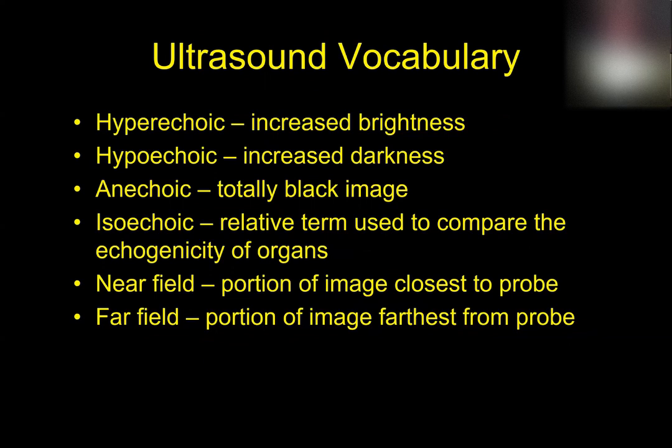So, and then he covered these terms, basic terms, just to make sure everybody knows. Hyperechoic is stuff on ultrasound that appears more white, more bright. Hypoechoic is the opposite. So hypoechoic literally means too few echoes. So that would be something that's a little darker on ultrasound.